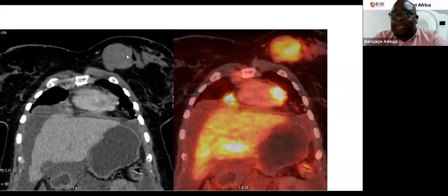So let's assume that it is a malignant lesion, and it's being taken off via mastectomy. So the patient, of course, would enjoy that opportunity of it being detected early and being free from having to do some repeat CTs, looking for supraclavicular, internal mammary, or axillary nodes. So this gives an advantage also, especially when we spot incidental findings, and we can make recommendations as to how patients can be further managed.